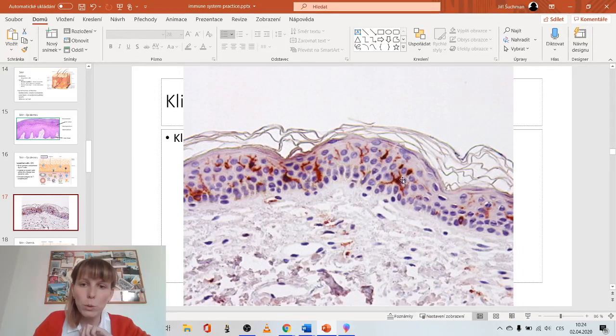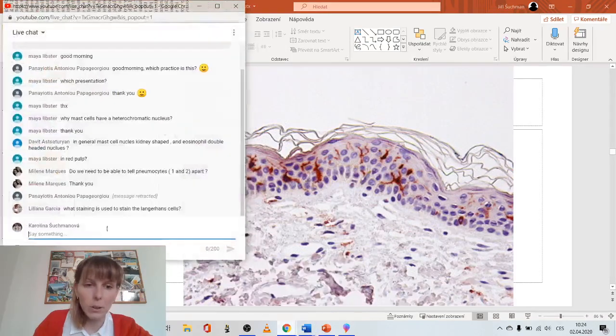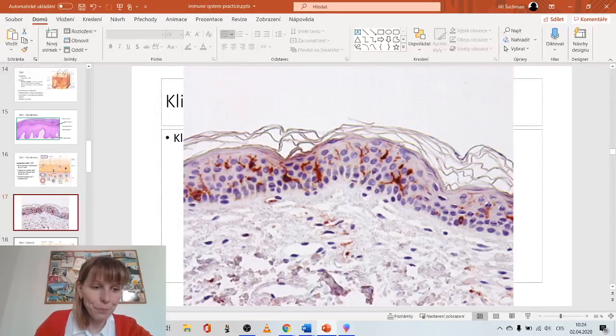This would be an antibody specific for a protein that is produced by the Langerhans cells and not by any of the other cells. But you can have antibodies for all different kinds of special cells, so you don't have to worry about it. It doesn't have a special name. It's just the immunohistochemical method. That's all you have to know.